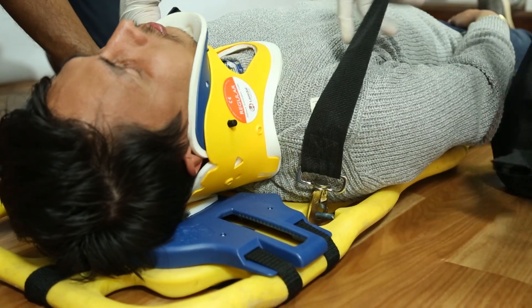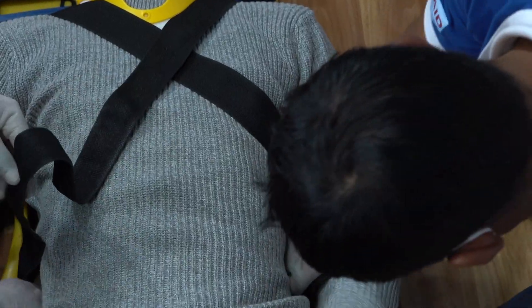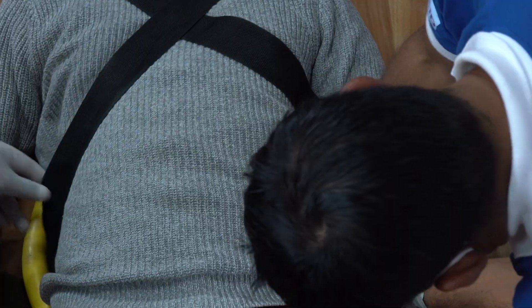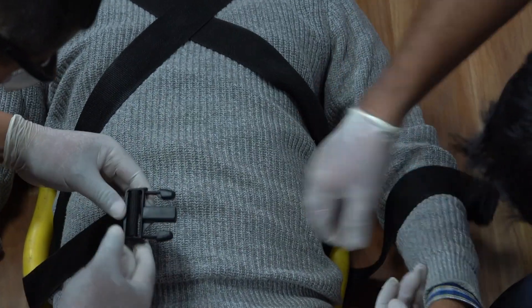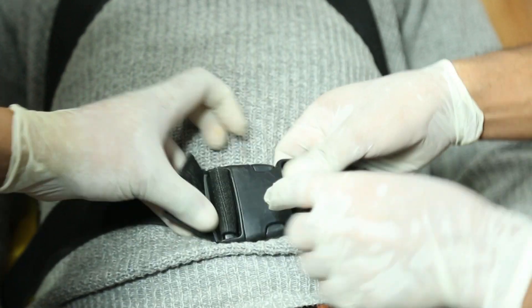Insert two hooks on the shoulder area of the board. Cross the straps over the chest and insert the ends of the straps from the inner part of the board. Fix the male and female ends together near the abdomen.